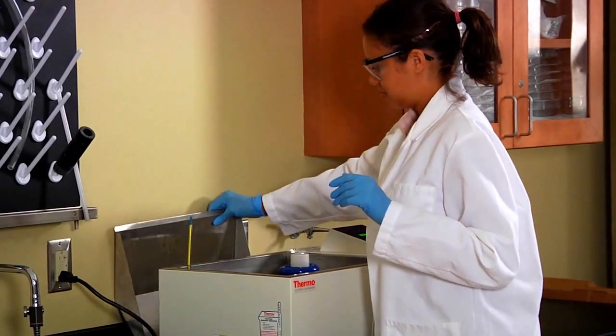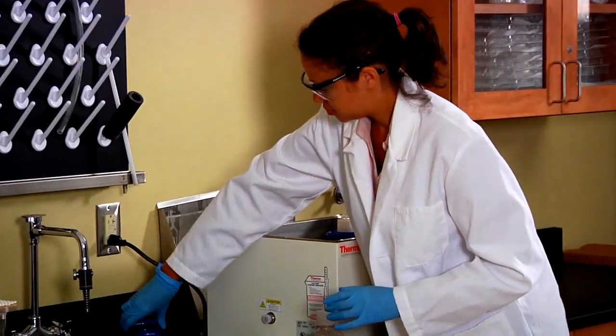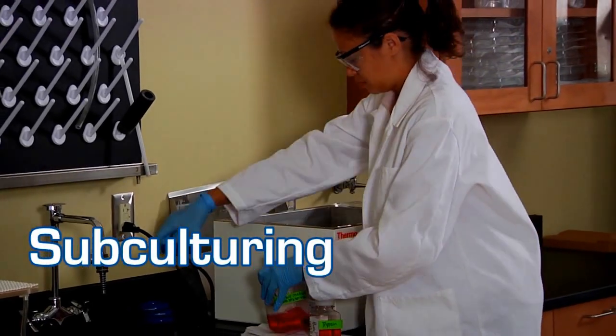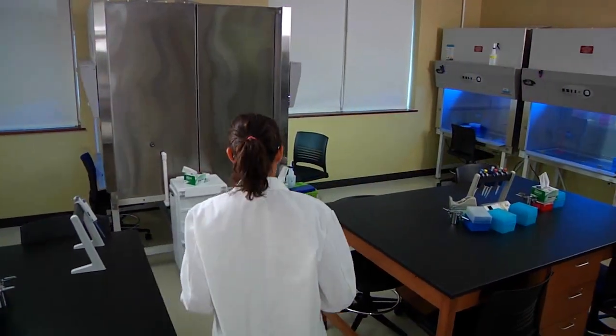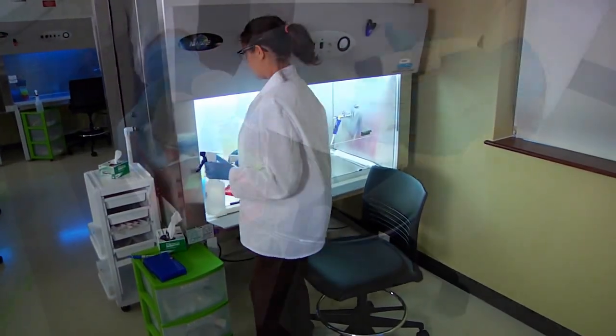As cultured cells grow and divide, they use up nutrients and eventually cells will multiply to a point that they run out of space in the cultured vessel. Subculturing is the process of diluting and transferring the cells into more vessels with fresh culture medium so we can produce a new culture and the cells can continue growing.